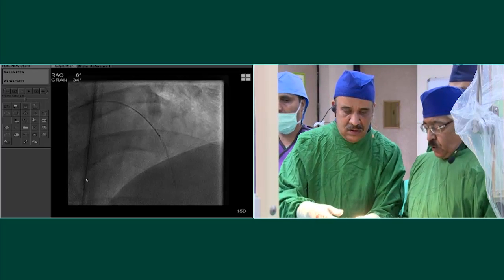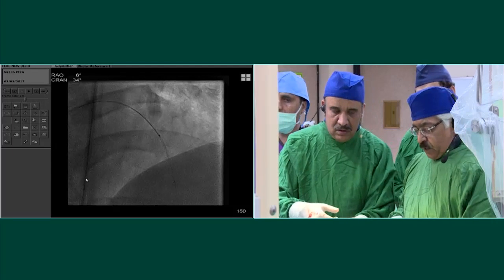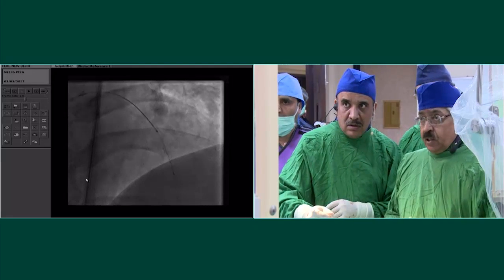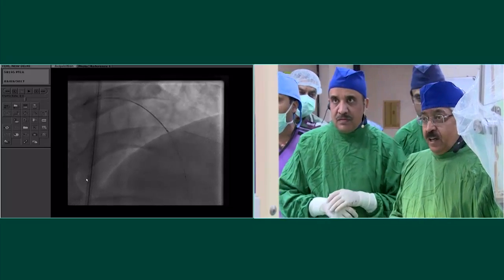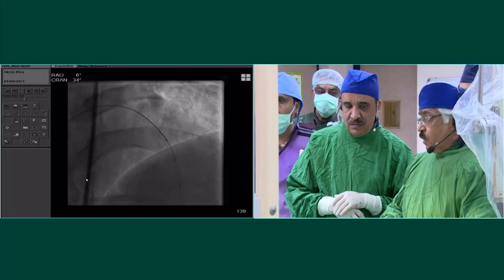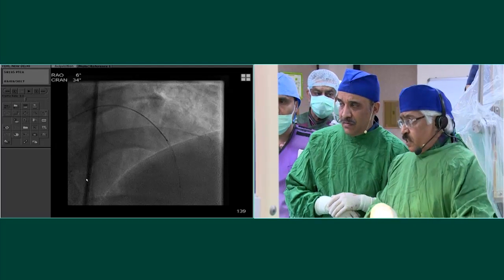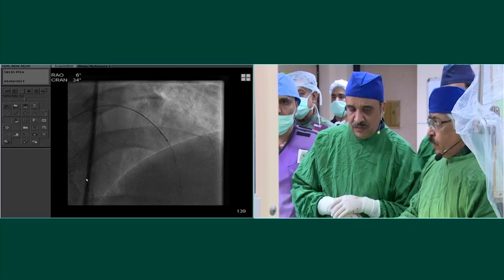So, fair enough, fair comment. But we still haven't learned whether it's this or it's post-dilatation. Post-dilatation is important, but we still haven't understood whether near optimal versus optimal is really making a difference. And as you know, I'm just firstly going to do this while you continue talking. But as you really know, some of the data shows that when you dilate these vessels aggressively, you don't necessarily have a great outcome in the first year. Okay, ready?